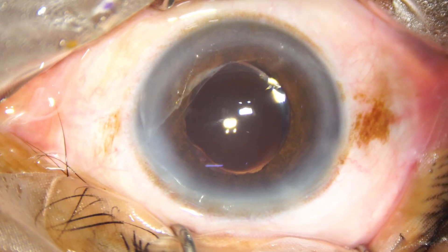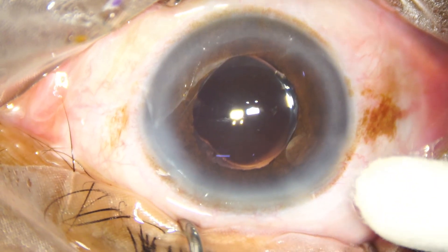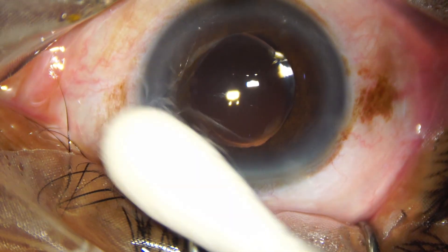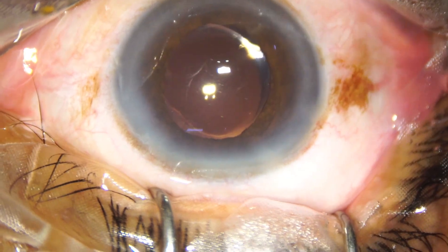Wait — surgery is not yet over. We have to check the wounds with a cotton-tipped applicator, apply a few drops of moxifloxacin over the ocular surface, and then conclude the case.